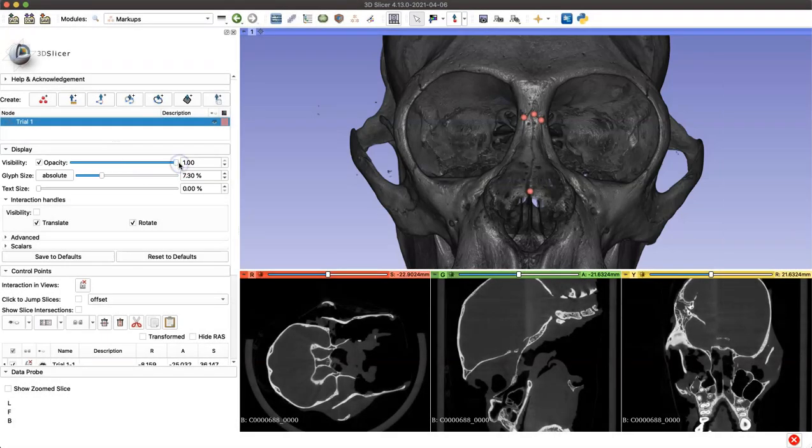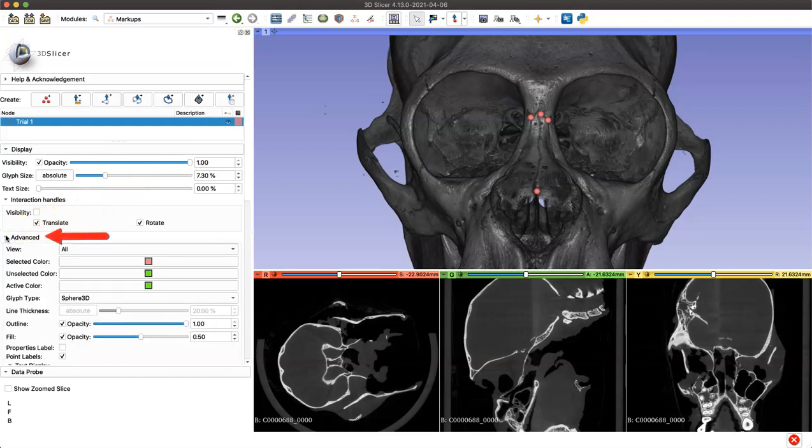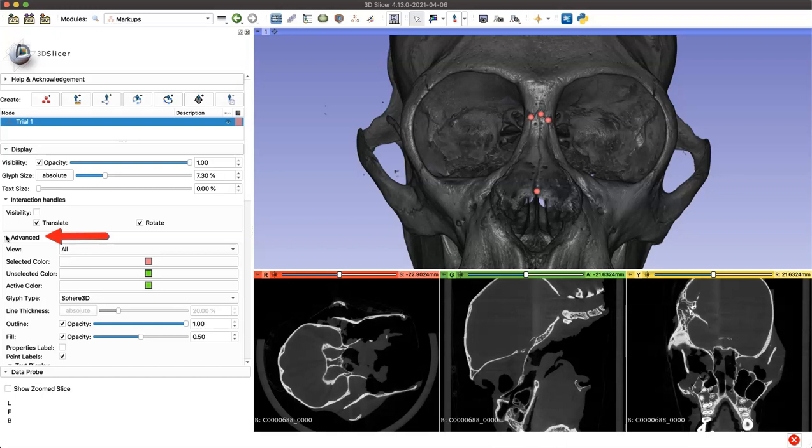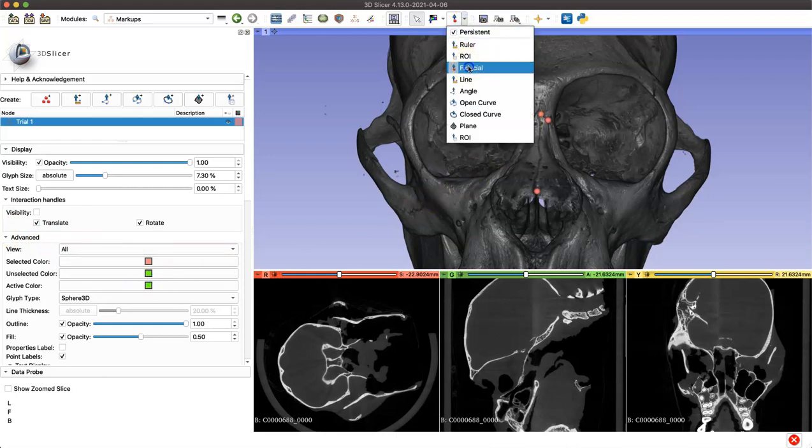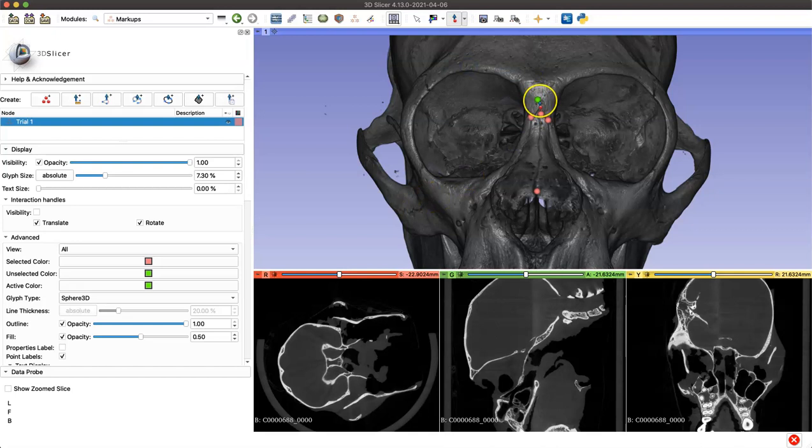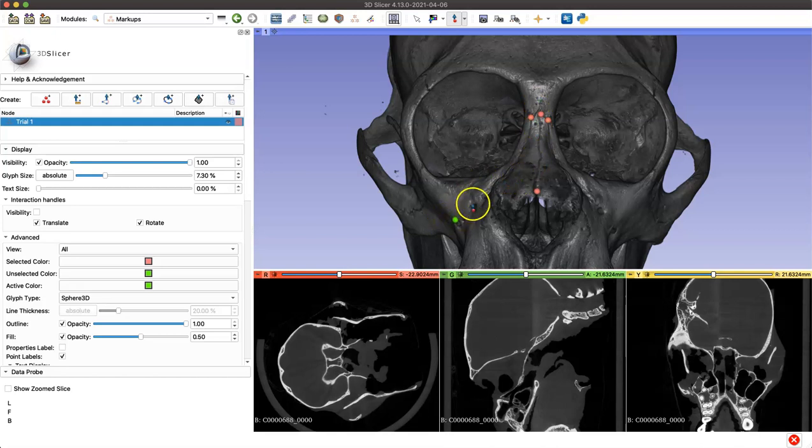If I open the advanced drop down menu, we have even more options to customize our markup's appearance. You can change the color of the selected or placed landmarks and the unselected or not yet placed landmarks. You can see it defaults my unselected landmarks to be set to green, but when I place them on the model, I'll just put one over here, they're going to change to pink because that's what I've set it to.